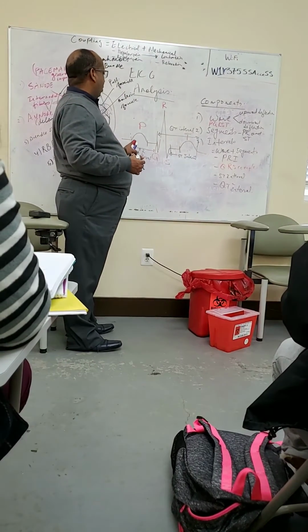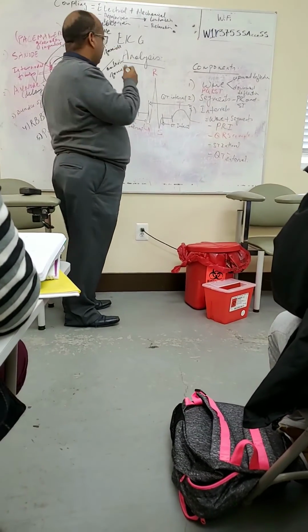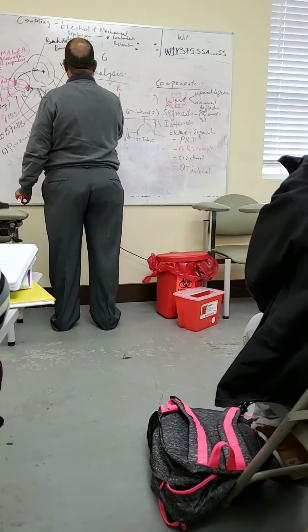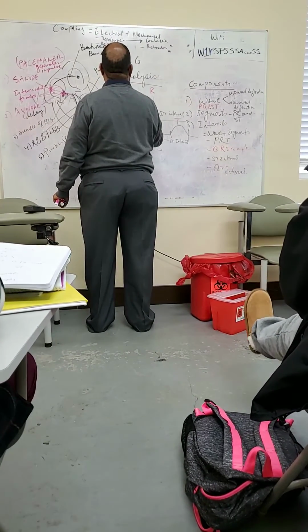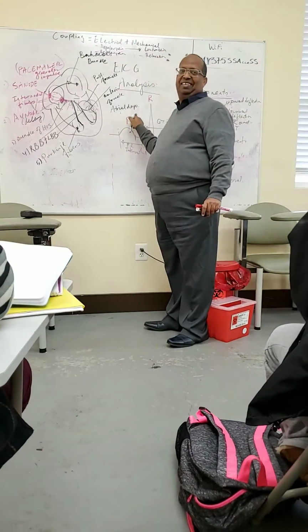So when we say P wave, what is this? This shows me atrial depolarization.